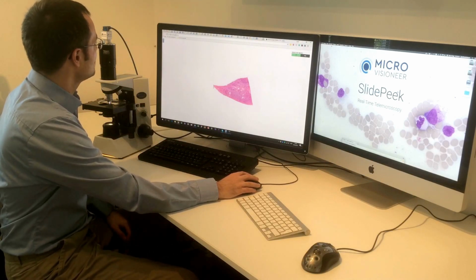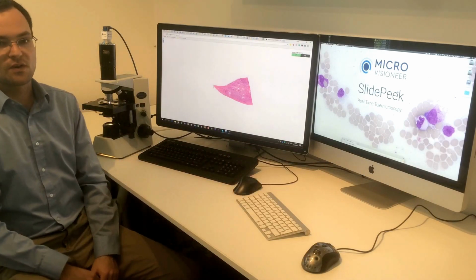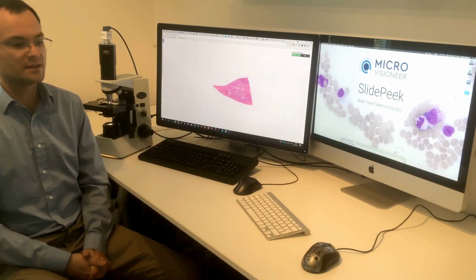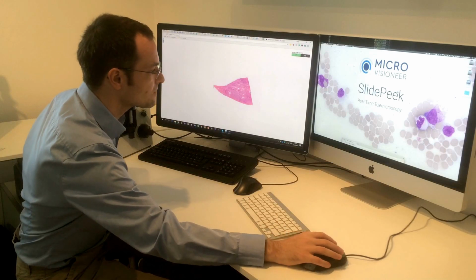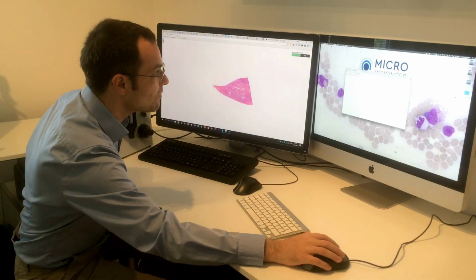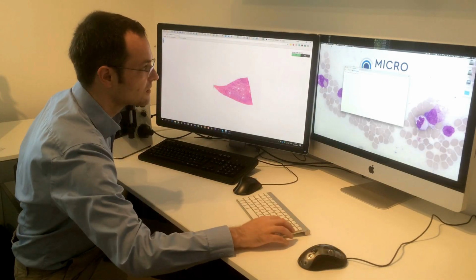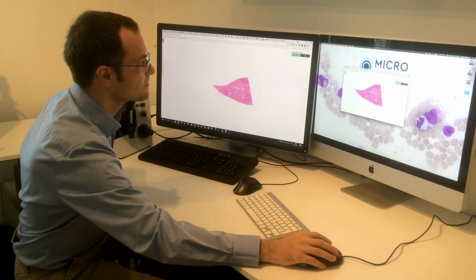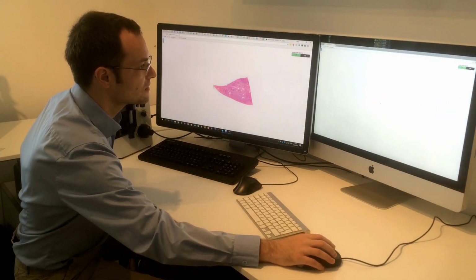Now it's a simple URL. Usually for the customer it's a difficult URL that you can share with your colleagues. So I will open this here on the other computer. Okay, you see, just make it full screen.